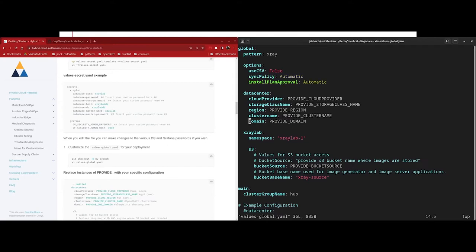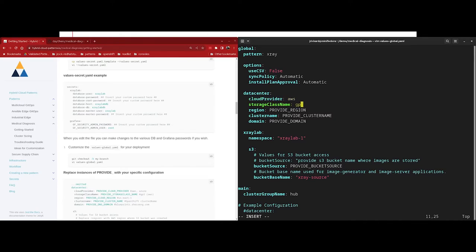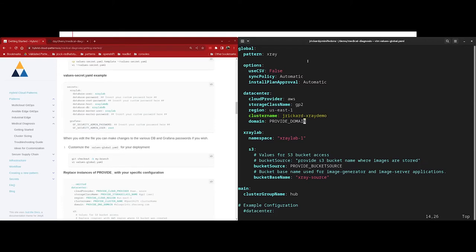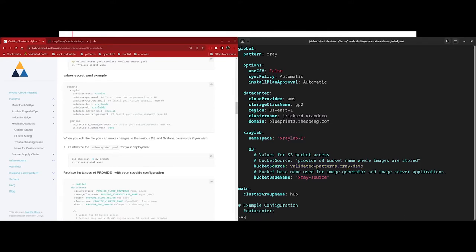Next, we have the install plan approval, and that's for the operator lifecycle manager to automatically approve the install plan for the subscription. If this is set to manual, then we would have to go into the OpenShift console and manually approve the install plan before the subscription would install. Now we need to define our cluster and cloud information. I'm deployed into AWS, so I'm going to change my cloud provider to AWS. My storage class name is GP2, and I've deployed my cluster in US East 1. My cluster name is jrecord-xraydemo, and my domain is blueprints.rhecoeng.com. I'm going to update this bucket source. Now this is the S3 bucket that we created during the prerequisites. So this is where we actually declare to the cluster the bucket name that we created.